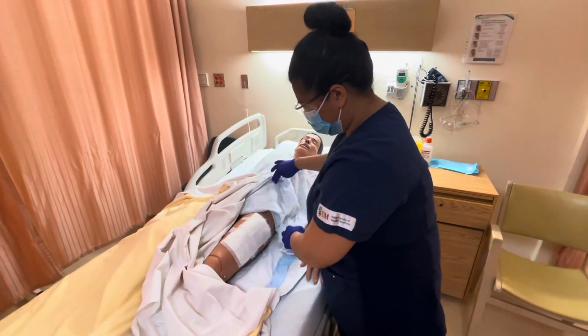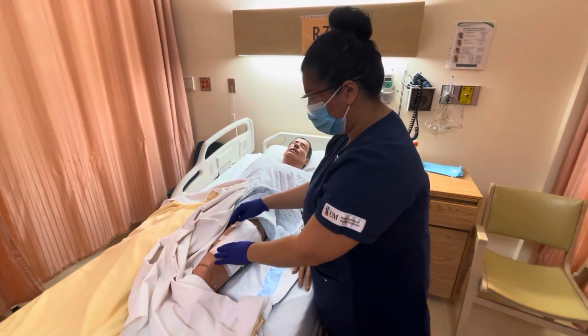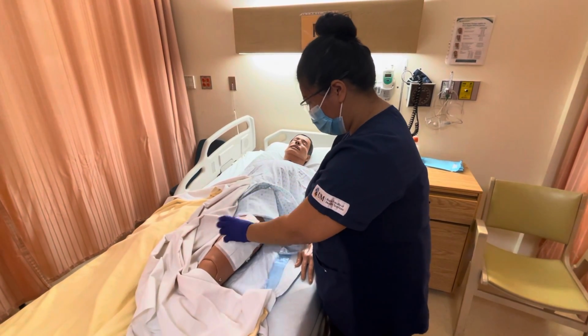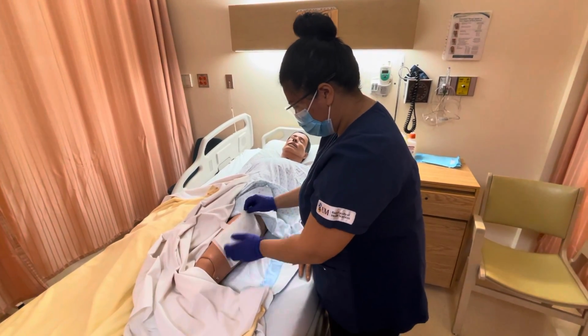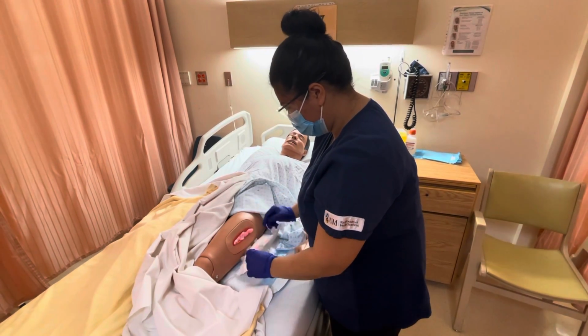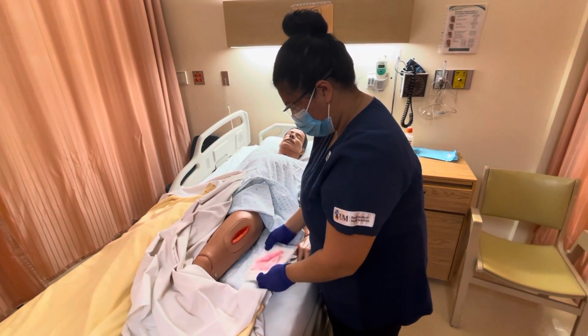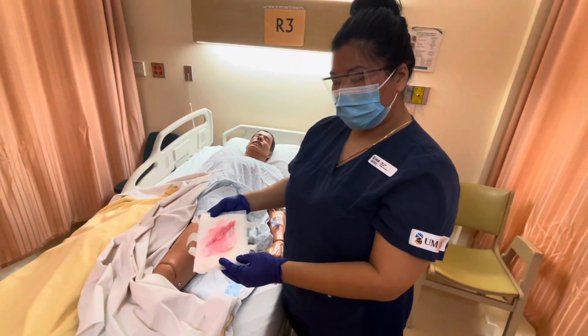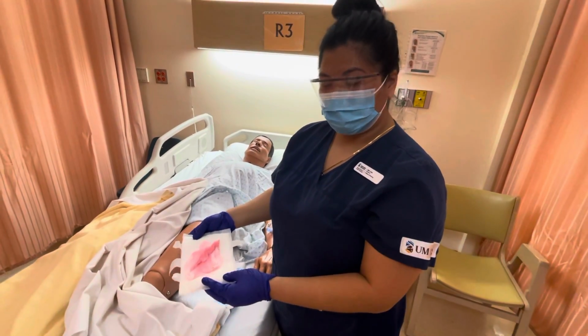Okay, so I'm just gonna expose your leg so we can check the wound. I'm gonna take off the old dressing now. We wanna loosen up the edges of the tape gently. And then we want to remove the old dressing, and then we want to assess the amount of exudate, the color, as well as if there's any odor.